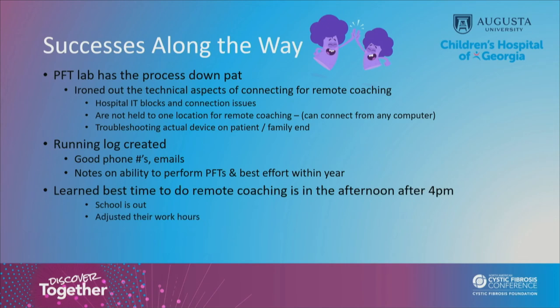They also have a record of the best effort within the year, so if the patient blows, and let's say their FEV1 is 76, but their baseline is, say, 98, then they know something's up and they can send a message to the provider in our portal.